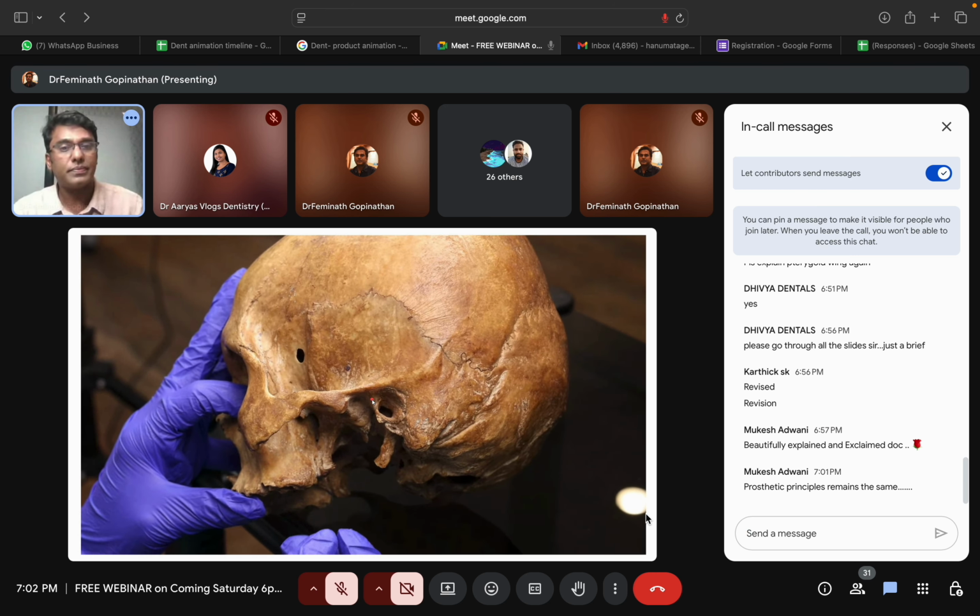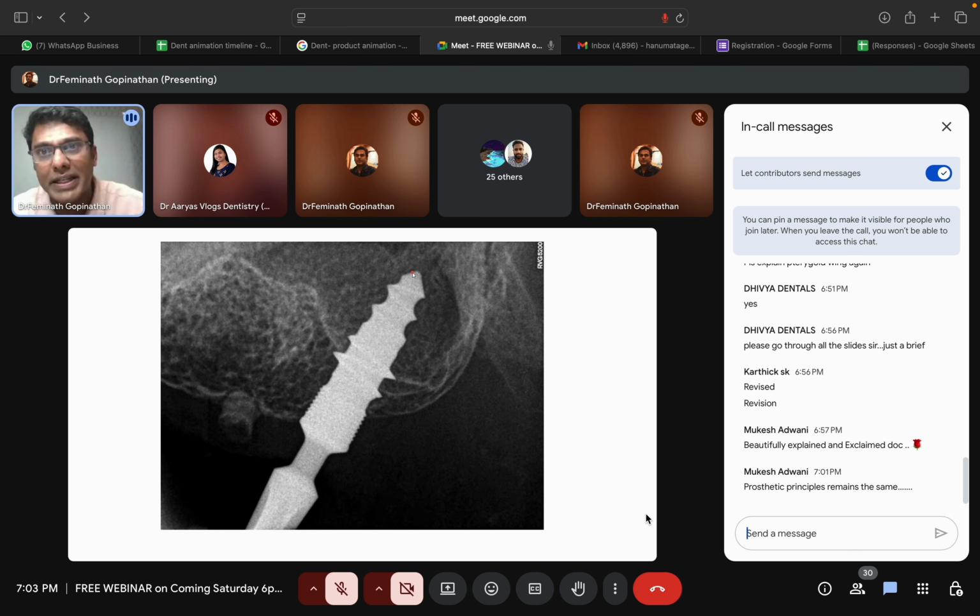So this I have shown you. This is how the lateral pterygoid plate is. This is the coronal section of the CBCT section. This is the sagittal section. This is on the process of placement. I just wanted to reconfirm whether I am directing this into this area. This is the junction of the lateral and medial pterygoid.